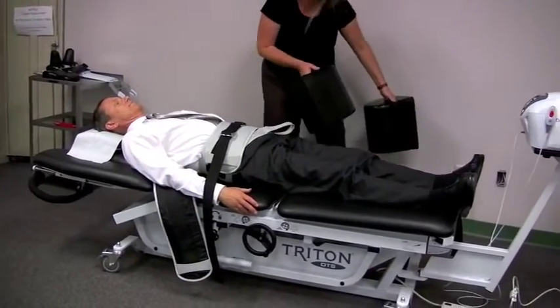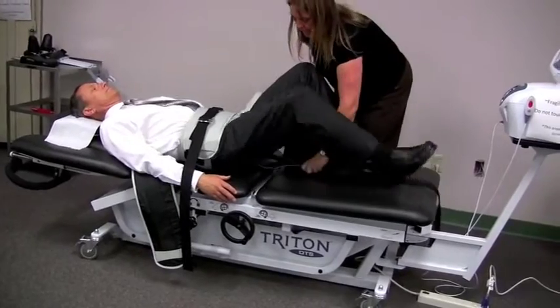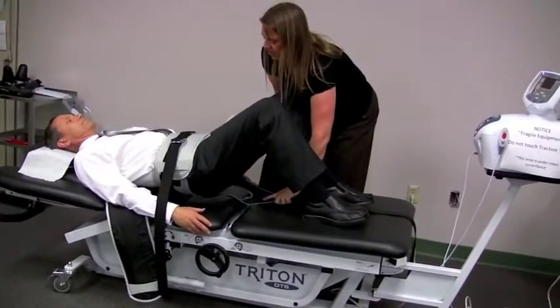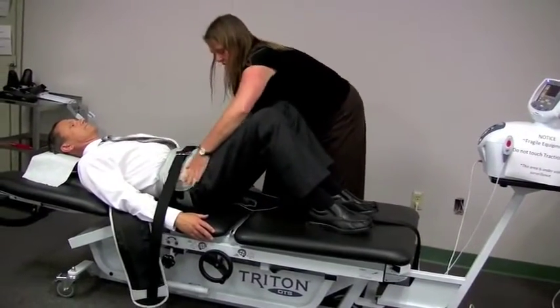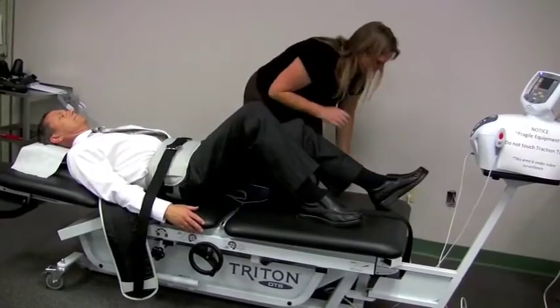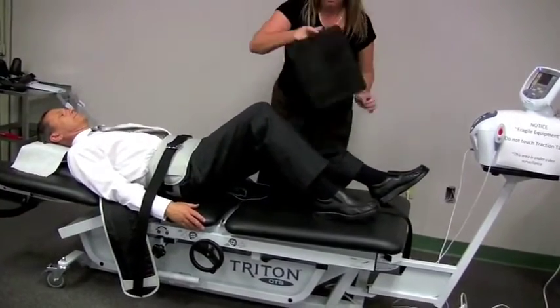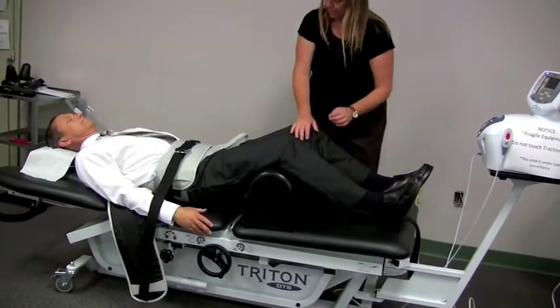So what I'm going to do is bend up your knees, and I'm going to have you lift up just a smidge. Good. And a little bit of adjusting here. There we go. I want this bottom piece to be as in the center as possible. These two leg pieces are going to go right here. Now, are you comfortable? Yes.